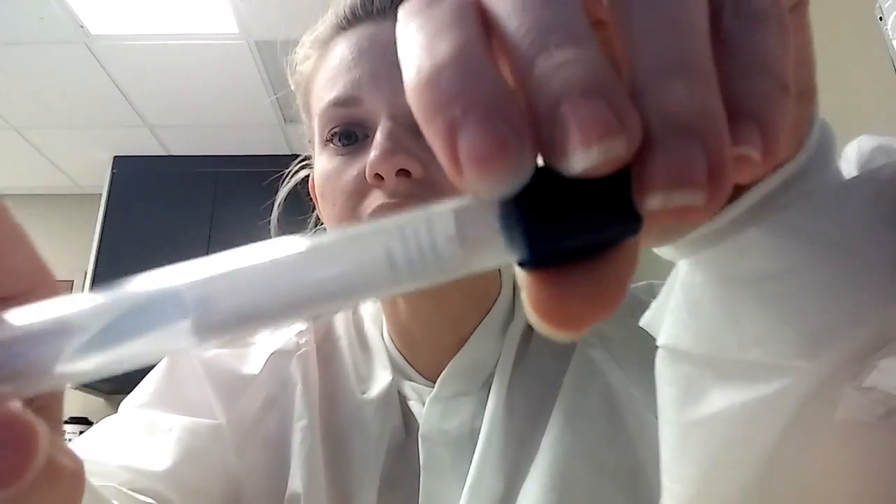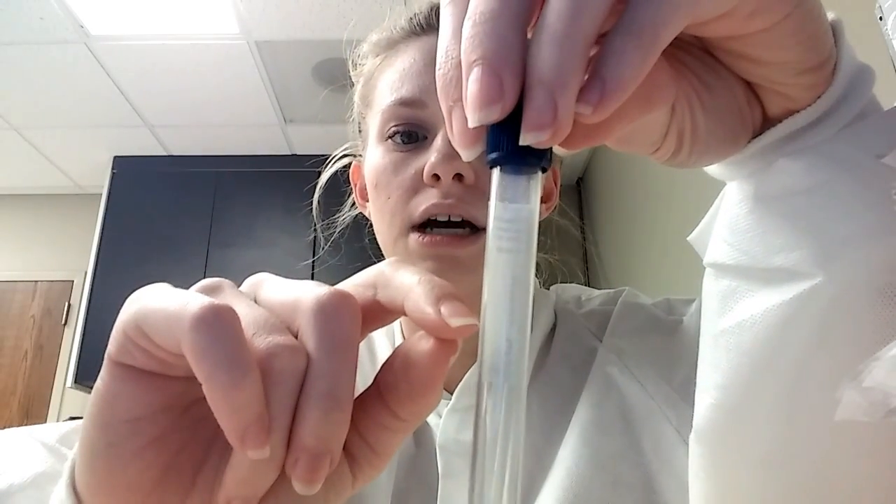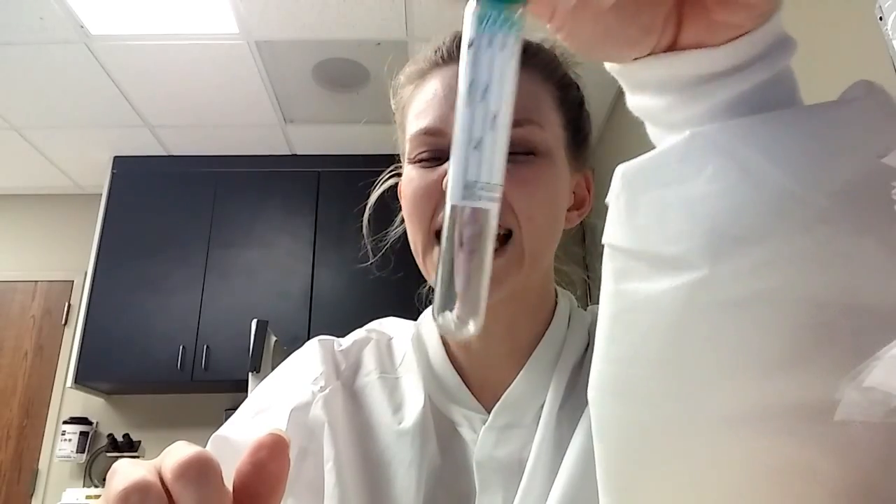This little blue tube — you can see some sprayed inside — has K2 EDTA like the purple, but these are treated for trace element detection. These are what we use for lead blood analysis. If you think someone has ingested some kind of lead, we draw this to find their lead levels.